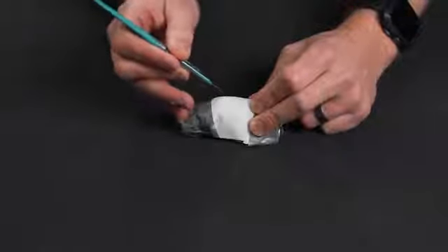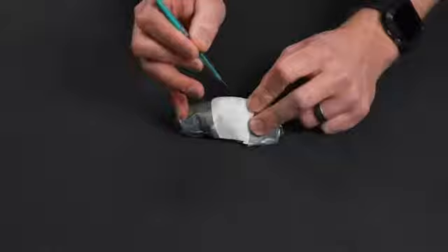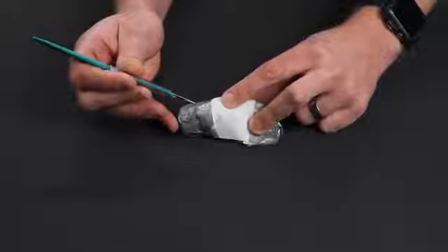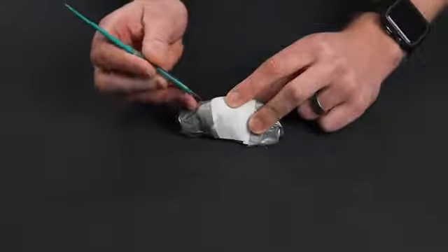The theory behind this is that this will allow me to mitigate any issues that might arise once I cut through the skin if there's a lot of bleeding. I don't have to rely on touch to find that landmark. I have the landmark, I can see the landmark hopefully, and now we're going to use this.